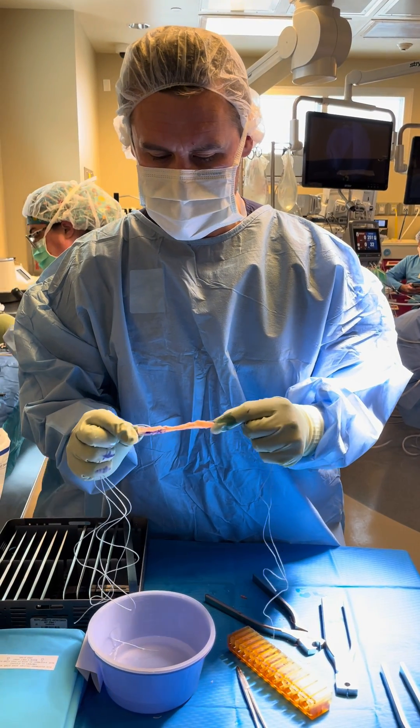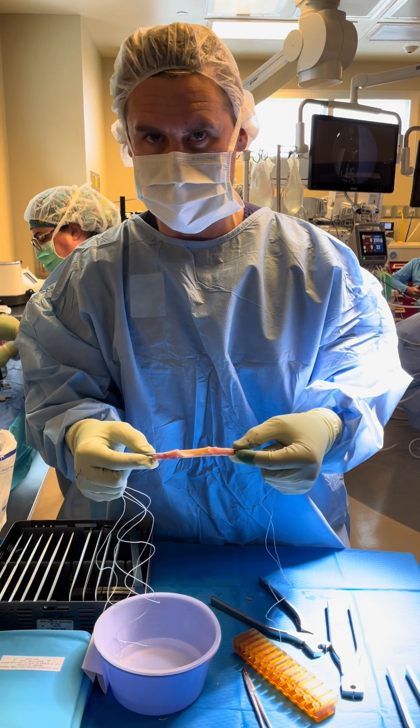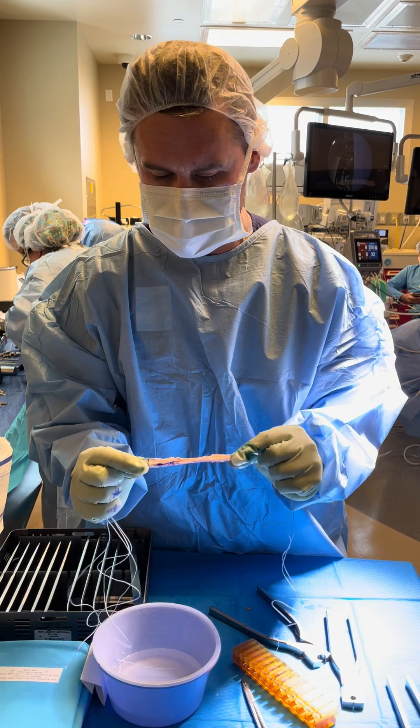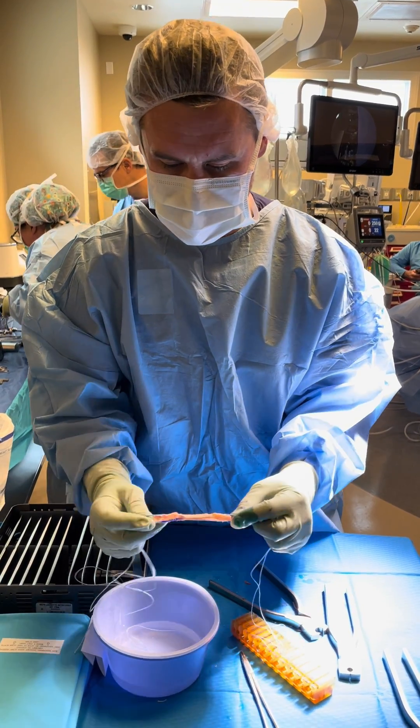This is an ACL surgery. This is a bone patella tendon bone autograft — this has come out of the patient. I just want to show you guys what we use here. This is used to reconstruct the ACL. You can come in a little bit closer.